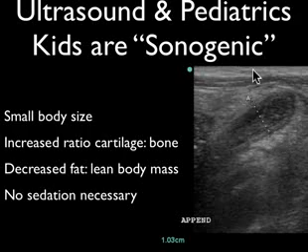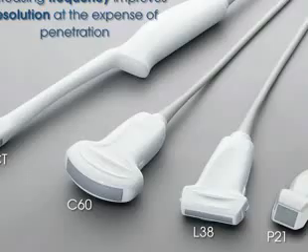And this is an example here of a patient who's got appendicitis, and this is what it looks like. This is the skin line up here. This is some muscle, and this is the appendix swollen right here, and it's greater than 6 millimeters. Actually, wall-to-wall measures 1.03 centimeters. And that's what acute appendicitis looks like.